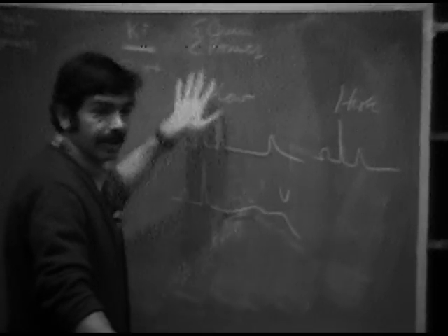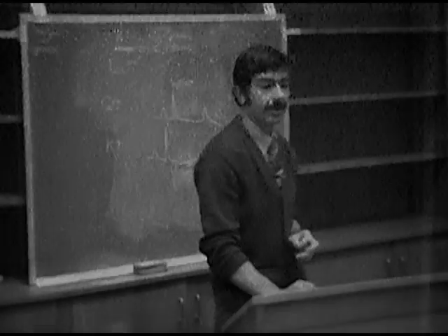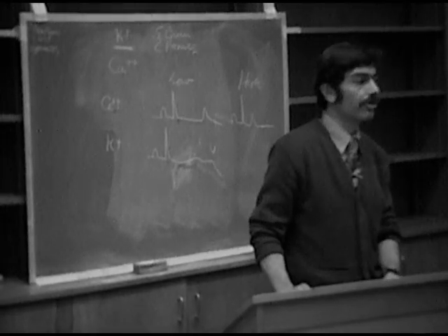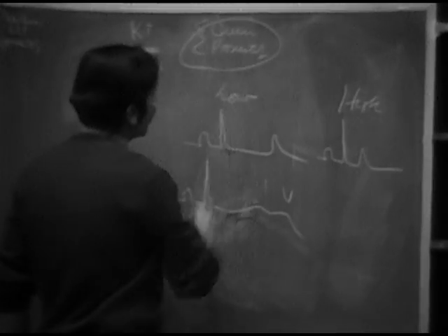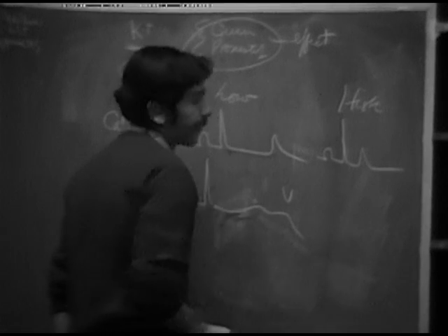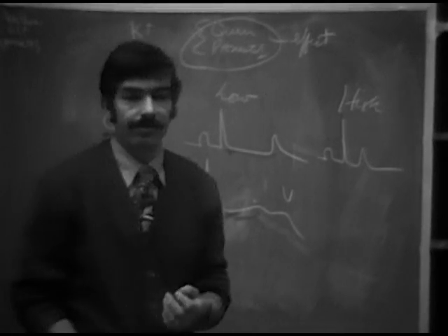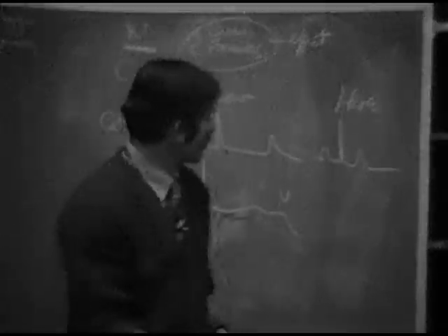So anyone that's taking these two drugs, you would have a lot of difficulty in saying whether they do or do not also have hypokalemia. So anybody on a standard maintenance dose of this drug will frequently have the appearance of hypokalemia on the electrocardiogram.